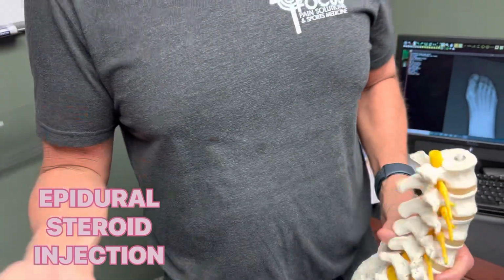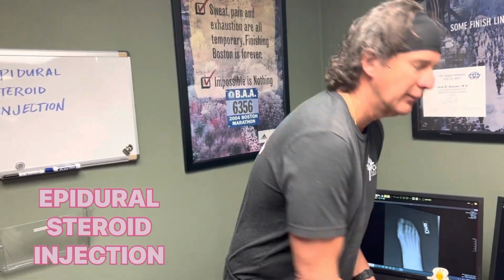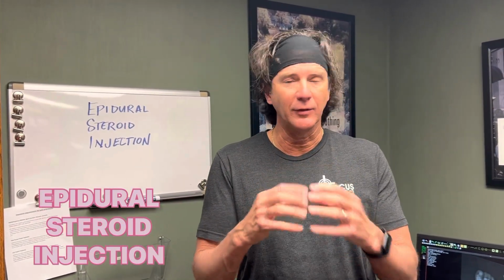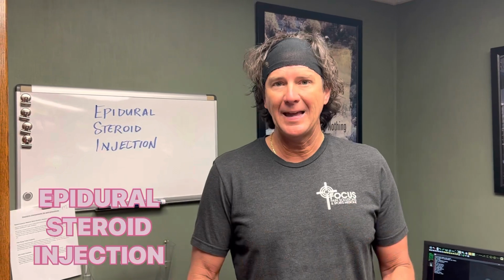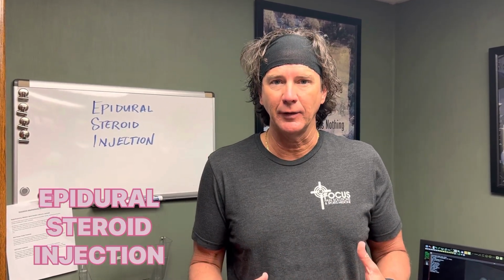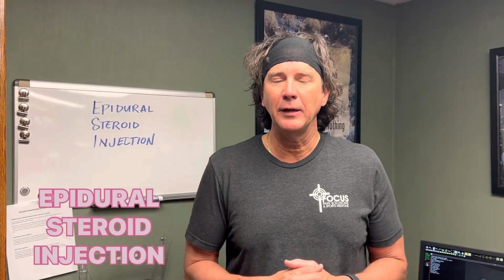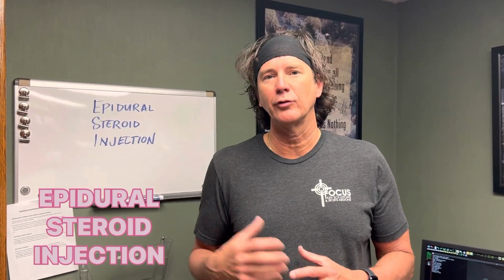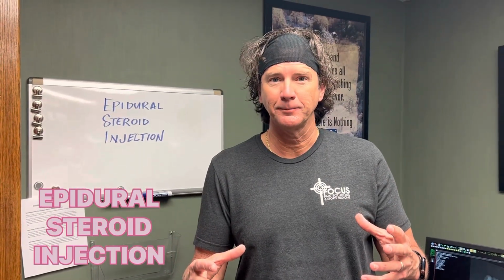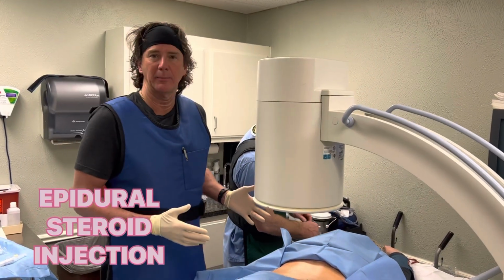If we can get that steroid on the disc and on the nerve, it'll take pressure off the nerve by decreasing the swelling in the disc. It's very effective for sciatic pain, for disc bulges, disc herniations, and even for degenerative disc disease. So we're going to go now. A patient has given us permission to video, and we're going to show you exactly what happens when you have an epidural steroid injection.